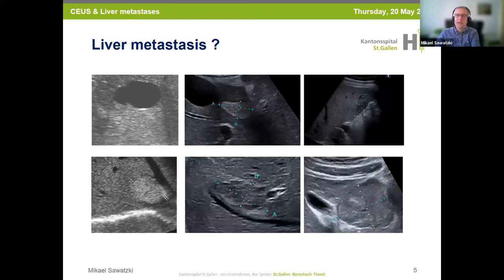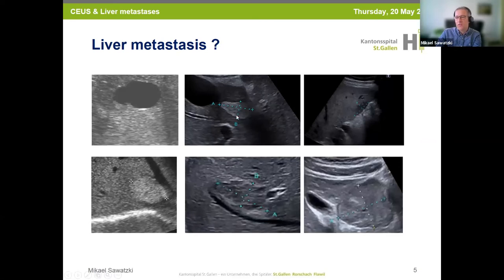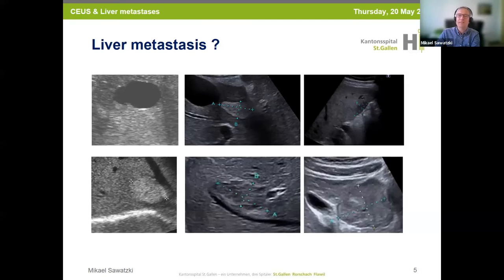With more information, you could more easily answer the first images. In absolutely asymptomatic patients without risk factors, on grayscale ultrasound you would diagnose a simple cyst, focal fat infiltration beneath the gallbladder, and focal fat sparing in the liver. In the case of an older patient with a past malignancy, a hypoechogenic lesion could be a liver metastasis. In these other cases, it's difficult or impossible to make a clear diagnosis on grayscale ultrasound alone.